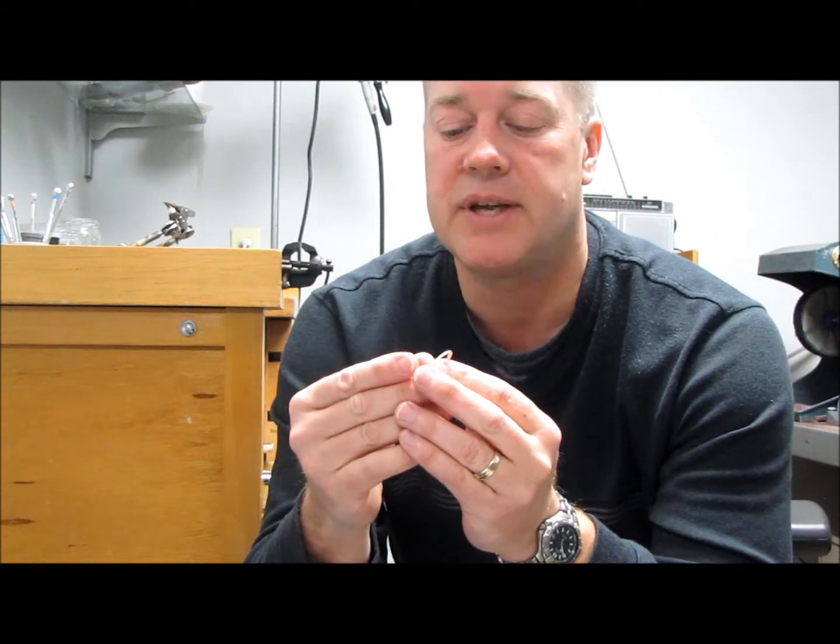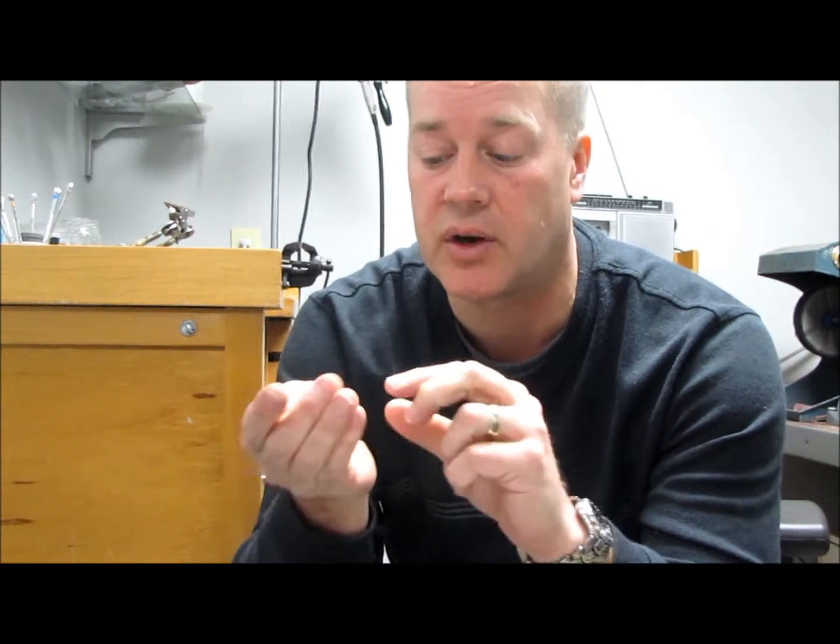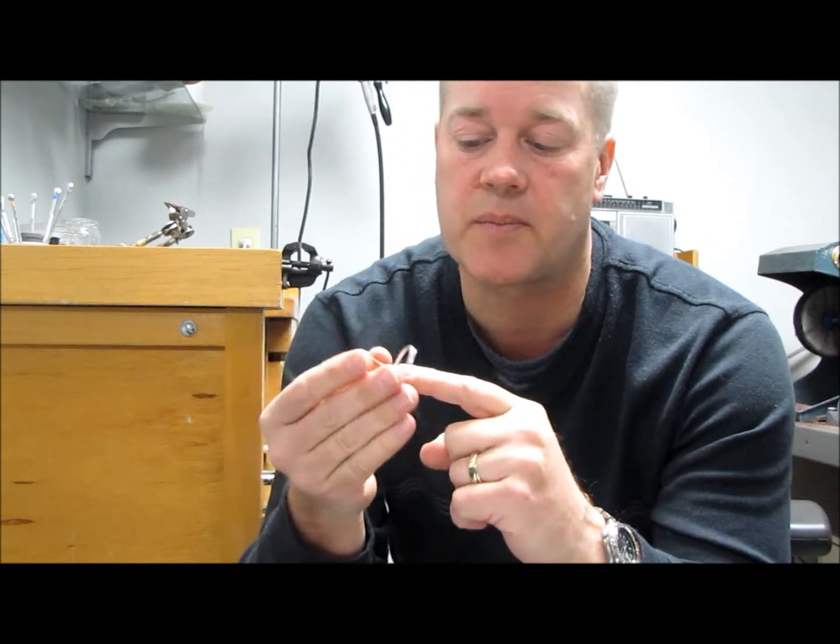I build them right here in my shop. Welcome to my shop. We have a measuring system where we measure the size of the ring that we need, proximal, distal, and we come up with our sizes. When you put this on, it allows you to fully flex like that, but it stops hyperextension. Hyperextension is anything that's past neutral. Neutral is straight. Straight is a good position to be in, but with a sensitive joint or a hypermobile joint, slight flexion is good, say perhaps at 5 degrees.